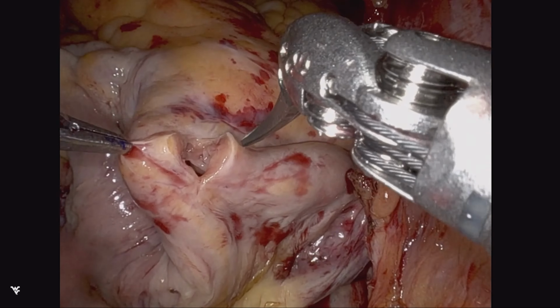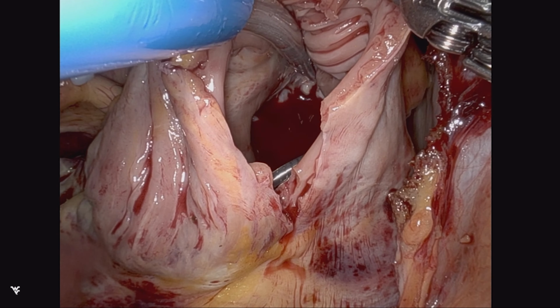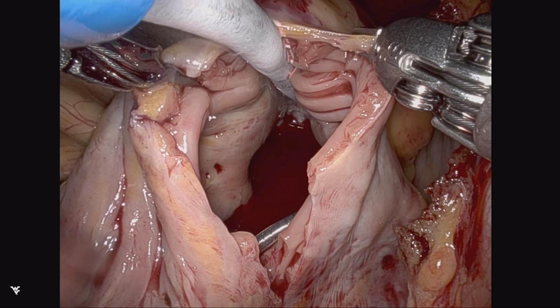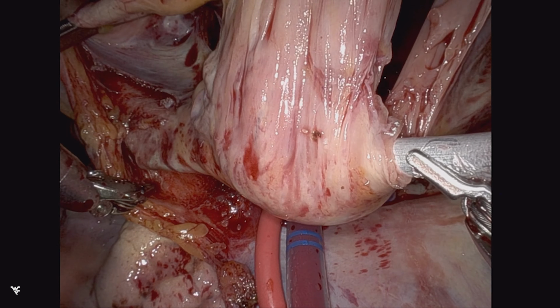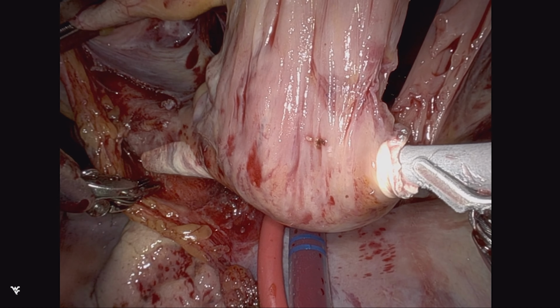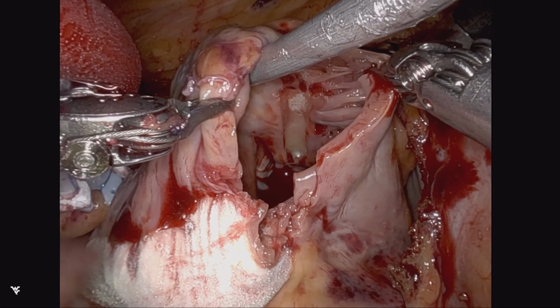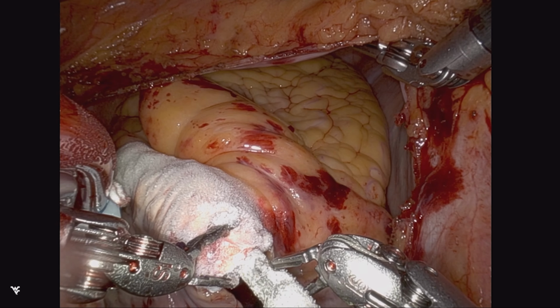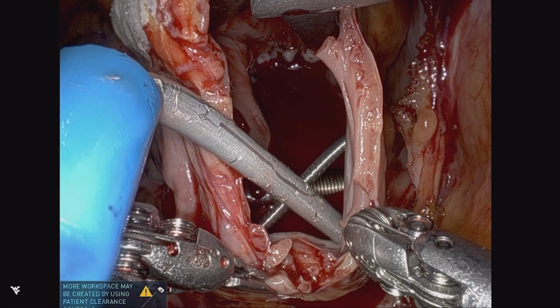So this is very important because we have to avoid jailing the atrial lead. So first the tricuspid line, and then the placement of the IVC line. Again, we don't snare to avoid any issues there. I want to make sure you get a good lesion that does not jail the lead. And then we can see the implant of the atrial lead is actually in the mid right atrial body. So this actually works out well. We can avoid that. And then the IVC line.